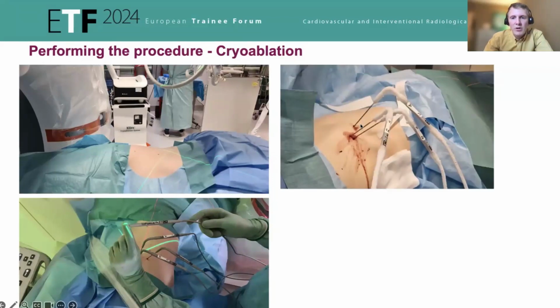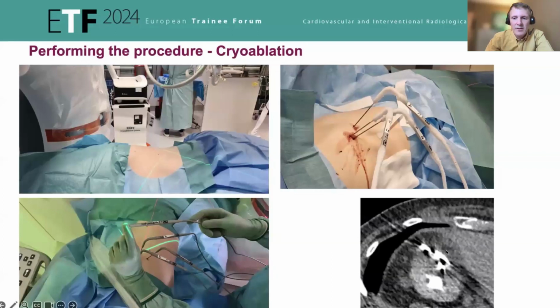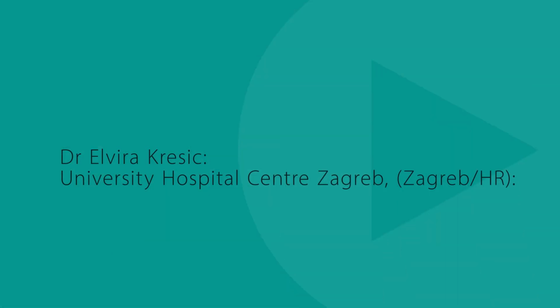And then when you start the treatment, you can see this is a cryoablation because you can also see the ice here on the several needles created along the shafts here. And this is a CT image of several needles around the ice ball that has started to be created.